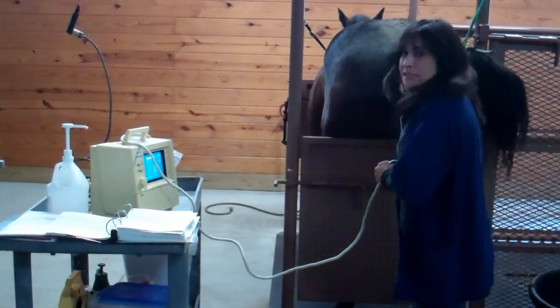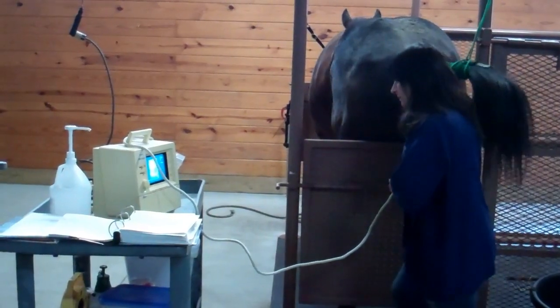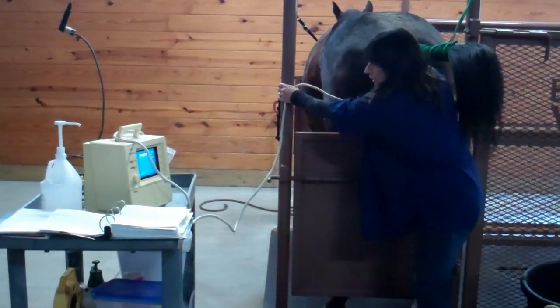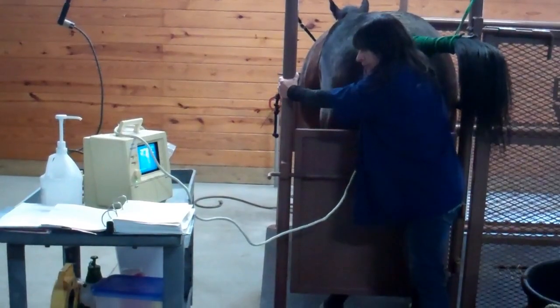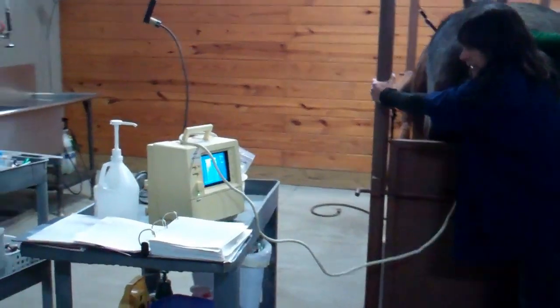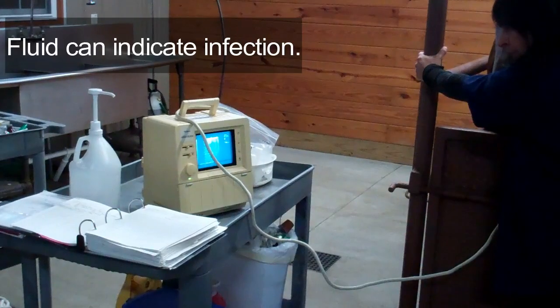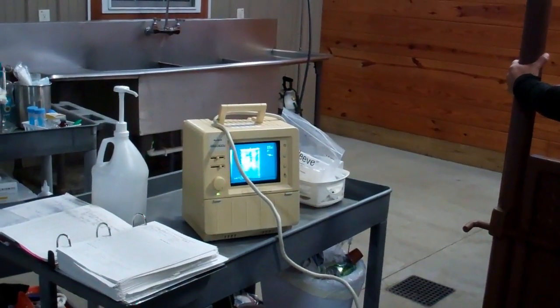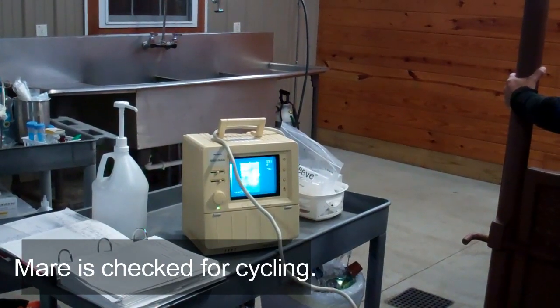And you're not going to miss any time, even if you want to breed early in the year. So right now I'm just going to scan her to get a baseline of what we have going on. I'm going to check her for fluid. The fluid at this time can be an indication that she has some infection or inflammation in her uterus. But this mare actually doesn't have anything. I can check to see if she's still cycling, and this mare is still cycling.